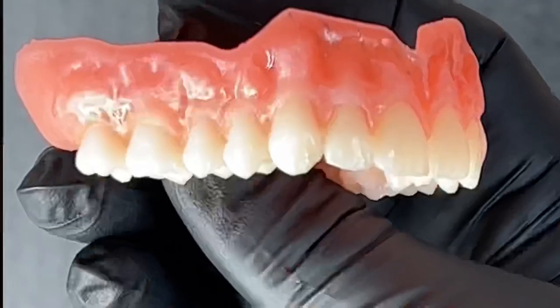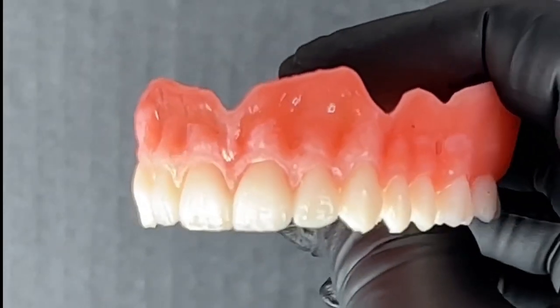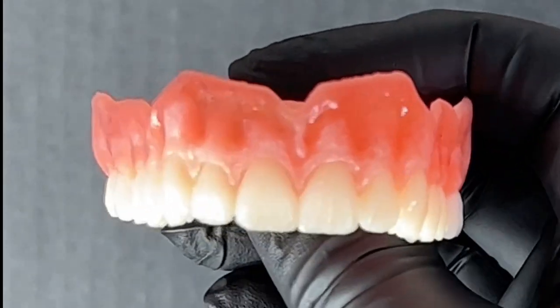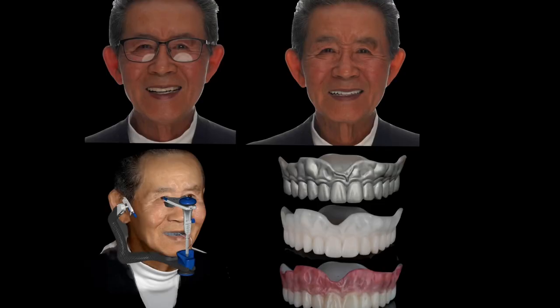From here we have a few options — you could add some custom characterization. Here's that denture with different lighting with a little bit of custom characterization painted on with Flexera, and then put it in the Otoflash for 3,000 flashes on each side. Remember to let it cool between those flashes, because Flexera base is a thermoplastic and high temperatures will distort it.